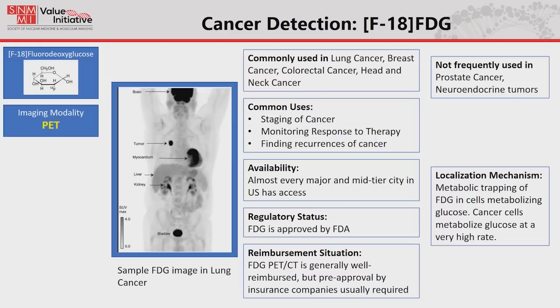So all of these slides coming up right now have the same format. You've seen the FDG ones. I'm not going to go into too much detail here, but I am going to go over the format. So in the upper left-hand corner is the molecular structure. I know you can't see it very well, and frankly, I don't care. What I want you to realize is they're just all different. So whatever the application is, the molecule has to be tuned to the physiology that we want to trace.